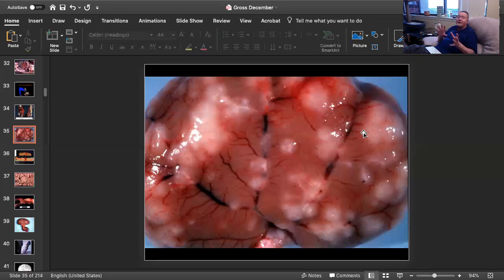Now, you always have this infiltrate which extends into the surrounding tissue. So I'm going to add the nephritis at the end. So a multifocal coalescing pyogranulomatous renal vasculitis with nephritis would be the way to go on this one. And the cause is a mutated feline coronavirus.